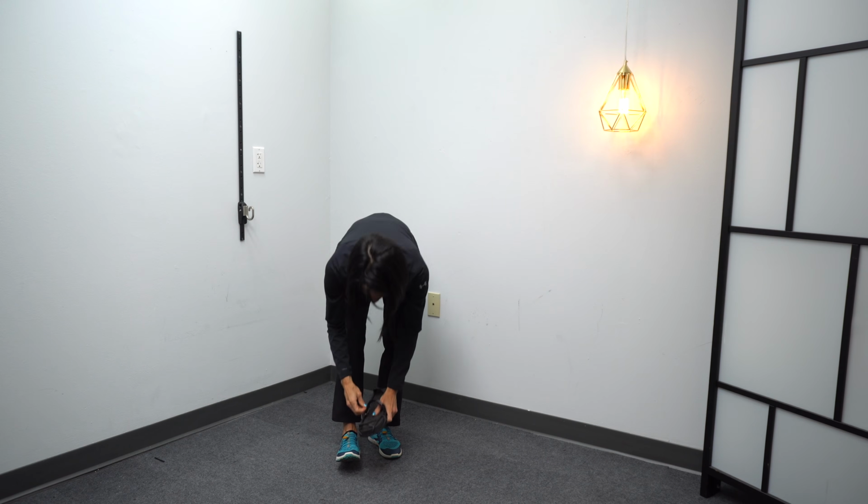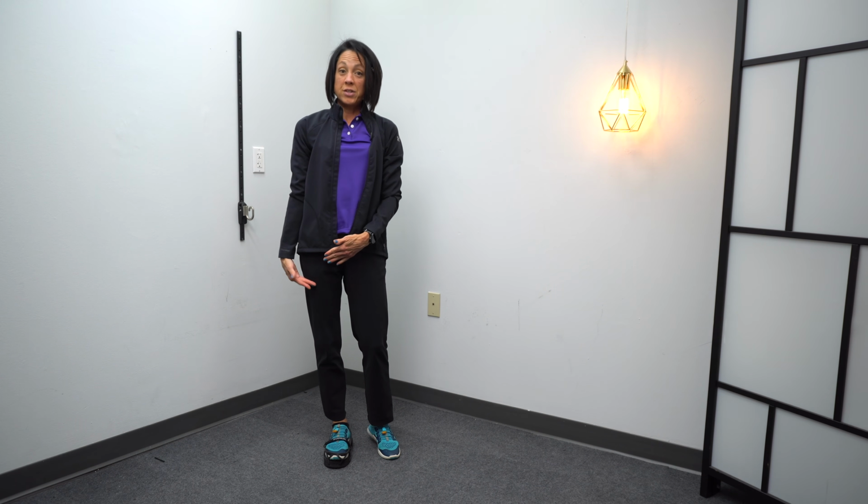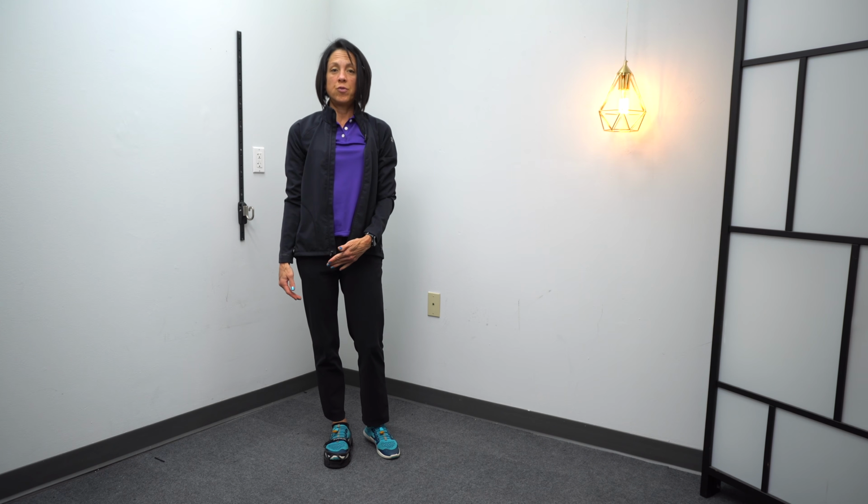All right, now the next tool is something called a level up or an even up. It's called an even up. It's made for people that are in a cast. You put it on the opposite foot to even your legs out. So it is elevated. Now, this tool goes on your uninvolved foot. All right, so now this tool is on the uninvolved foot.